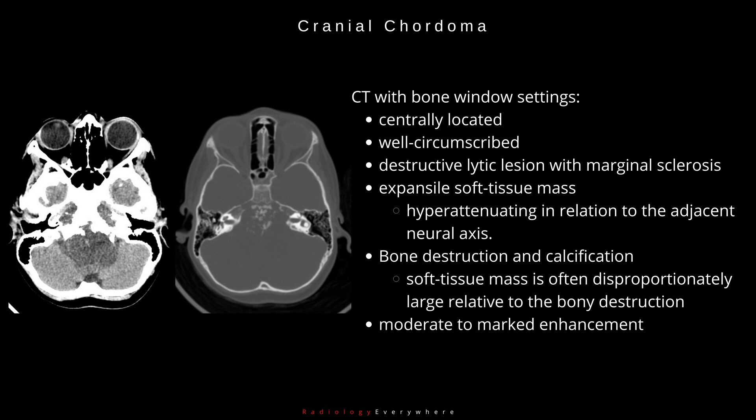On CT with bone window settings, chordomas appear as centrally located, well-circumscribed, destructive lytic lesions with marginal sclerosis and an expansile soft tissue mass. They are hyperattenuating relative to the adjacent neural axis, with bone destruction and calcification. The soft tissue mass is often disproportionately large relative to the bony destruction, and there is moderate to marked enhancement.